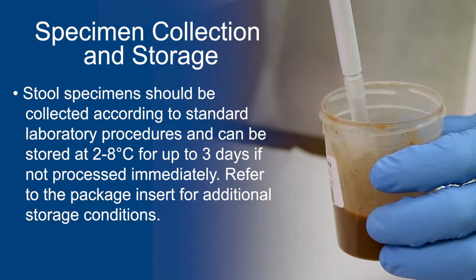Stool specimens should be collected according to standard laboratory procedures and stored at 2 to 8 degrees Celsius for up to 3 days if not processed immediately. Refer to the package insert for additional storage conditions.